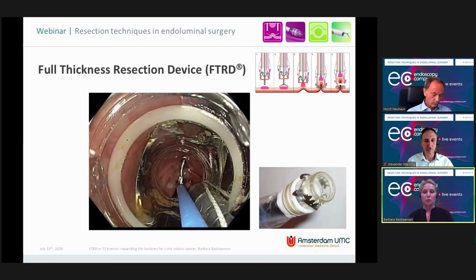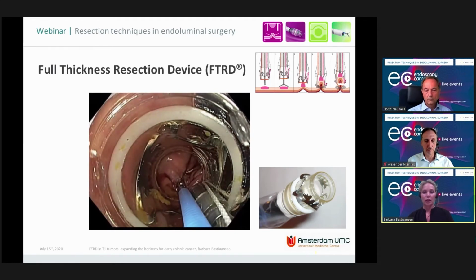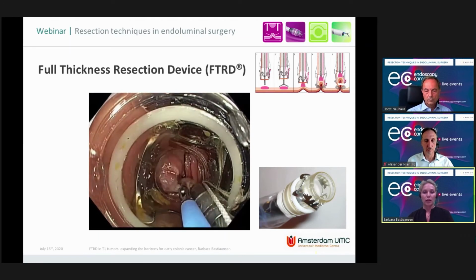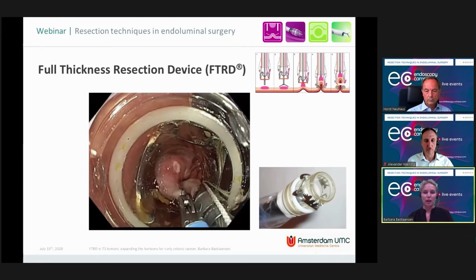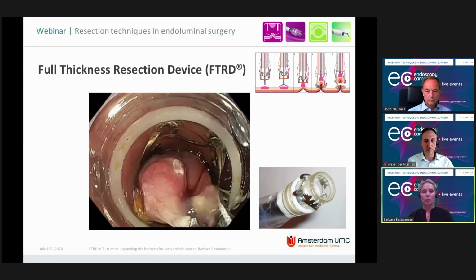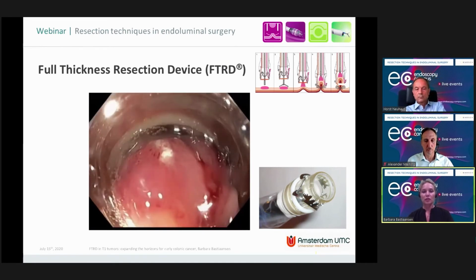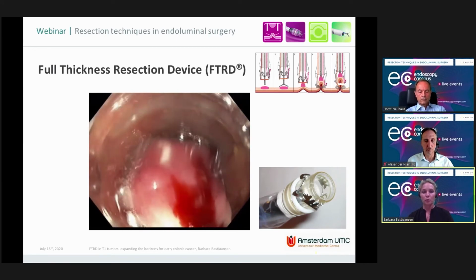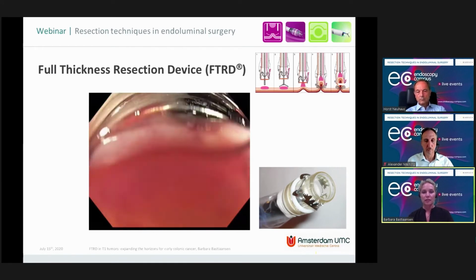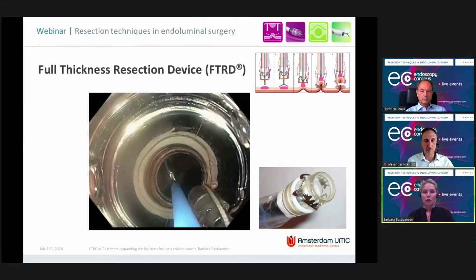Grabs the tissue. And then by pulling slowly, you see here the colonic wall is nicely mobile, and we need to take some time, but then it really mobilizes into the cap with all the markings. When the cap is a little bit filled, we apply some extra suction. Then here the clip is being released, white ring being pushed forward, tissue resected, and then comes out, and we need to pin that down for histological assessment.